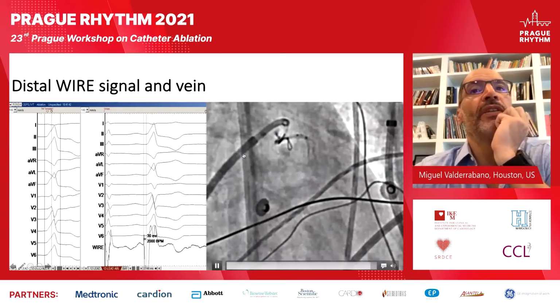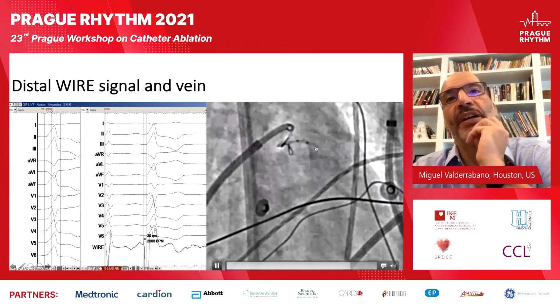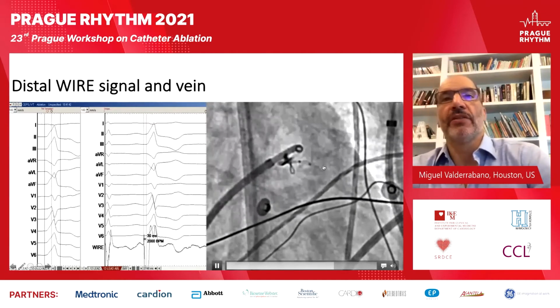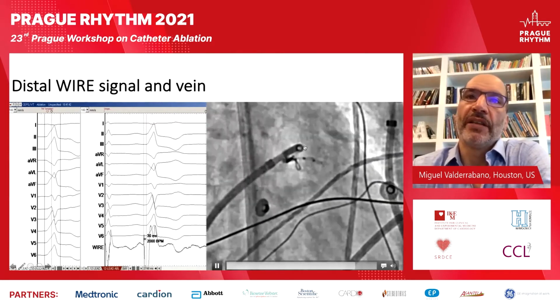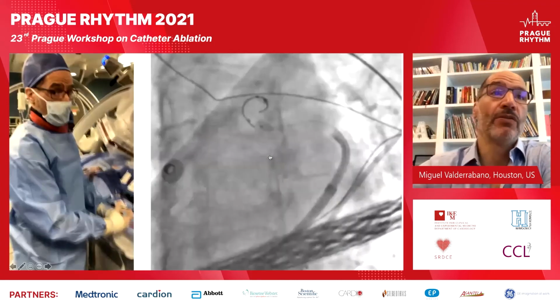And when we pulled the distal wire out and injected alcohol, we saw how there are these deep septal branches. We do not really want to give alcohol going deep into here. So it confirmed that we really wanted to use the two balloons, block distal flow with the distal wire, and inject alcohol in the proximal wire and sequester or block the alcohol in between the two.